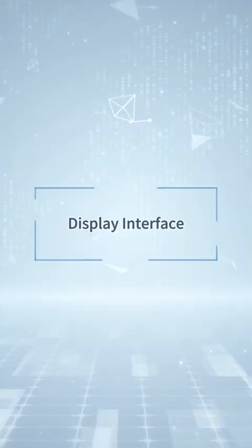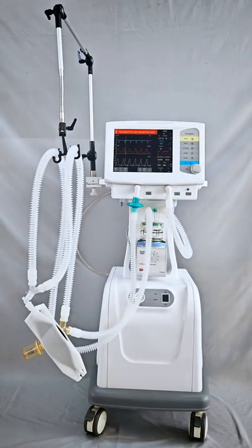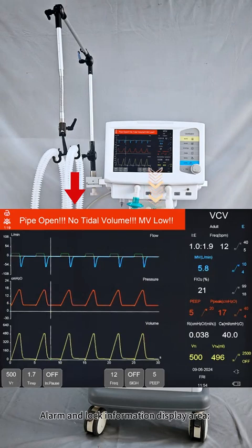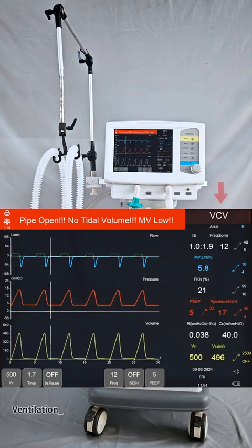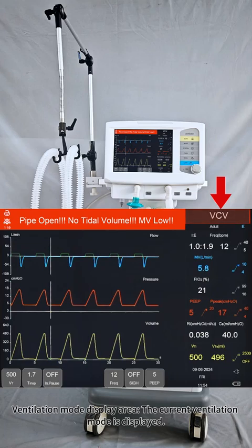Display interface. Alarm and lock information display area. The mute 120 seconds countdown, current alarm information and lock are displayed. Ventilation mode display area. The current ventilation mode is displayed. Patient type display area. The current patient type, adult or pediatric, is displayed.